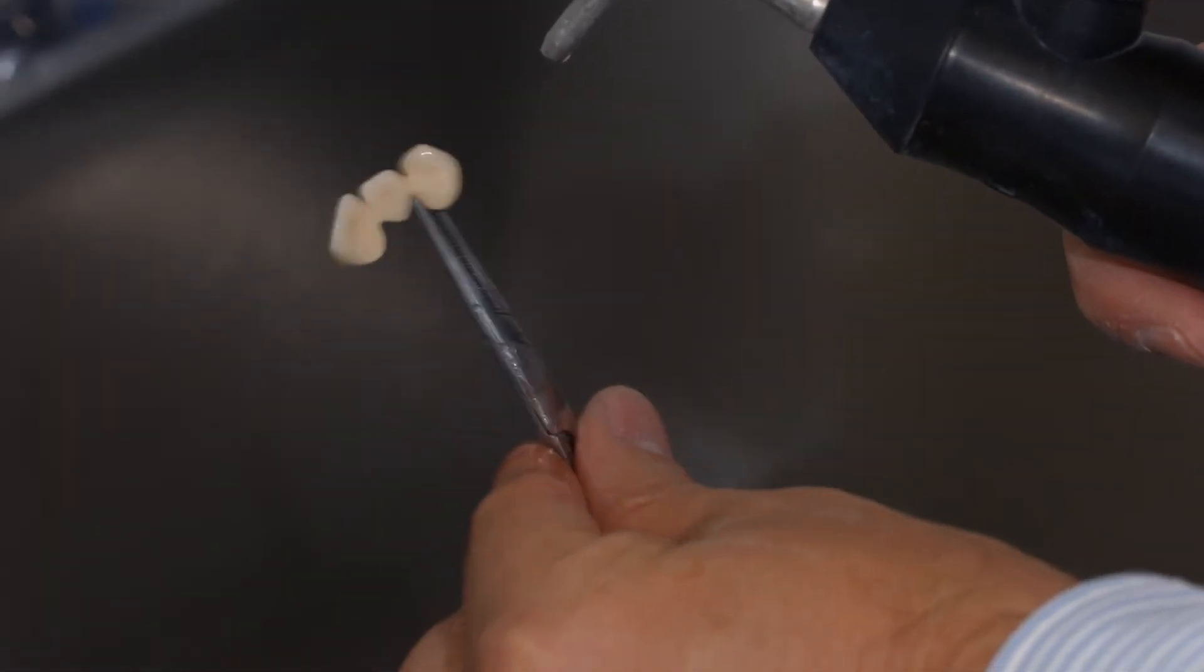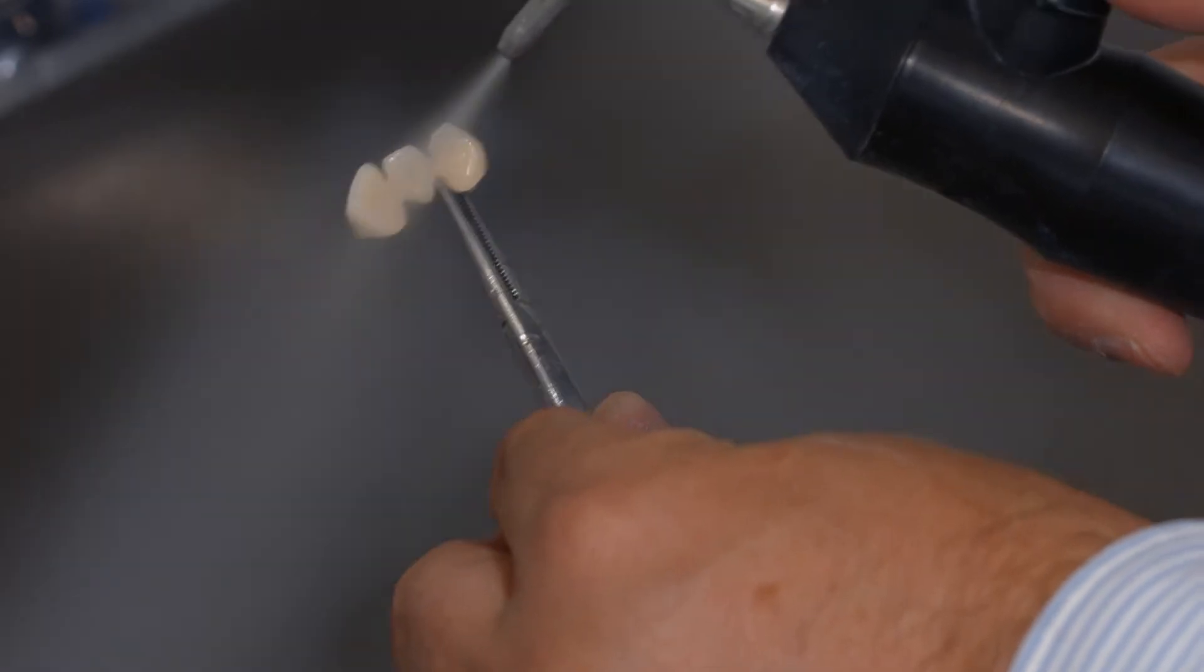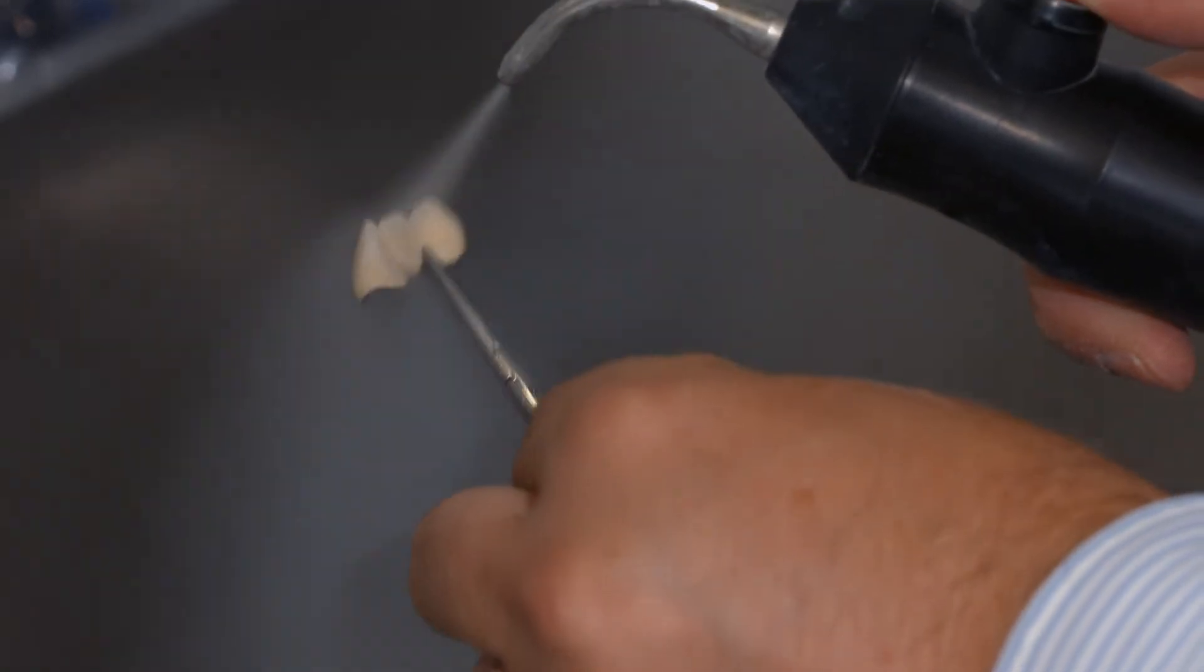Thoroughly clean the restoration with the steam jet and dry it with oil-free air before you start characterizing and staining its surface.